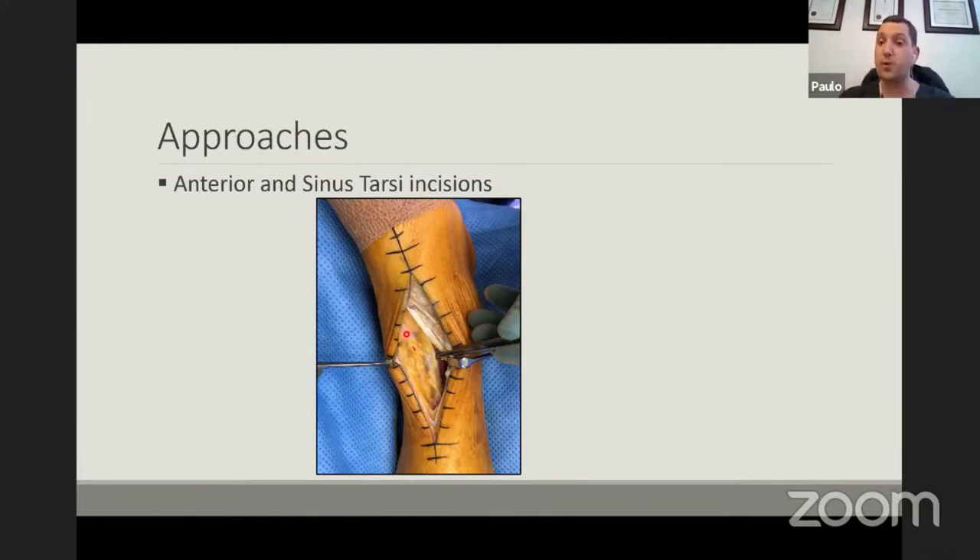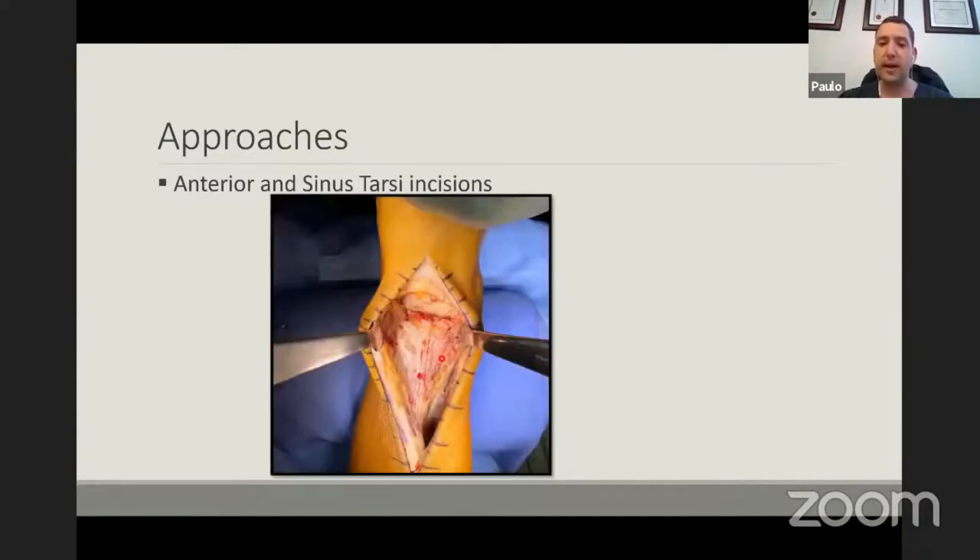The anterior approach is often feared because of the neurovascular structures there. But actually, if you just push the EHL out of the way, the bundle is directly underneath it — you just push it laterally and then you can develop your plane. As you can see, you get a very good exposure of the ankle itself.